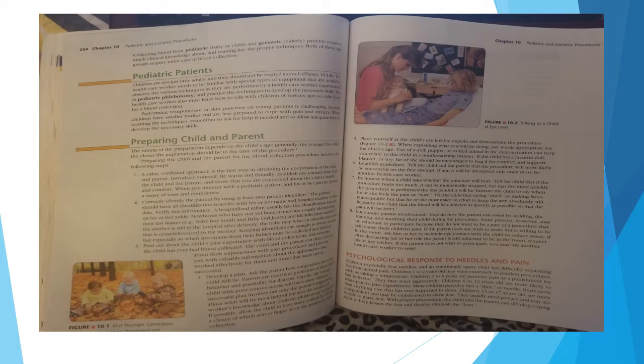Tell the child and the parent that the procedure will most likely be successful on the first attempt. If not, it will be attempted only once more by another healthcare worker. Number 7, be honest. When a child asks whether the puncture will hurt, tell the child that if the procedure hurts too much, it can be momentarily stopped, but that the more quickly the procedure is performed, the less painful it will be. Instruct the child to say when he or she feels the pain or hurt.